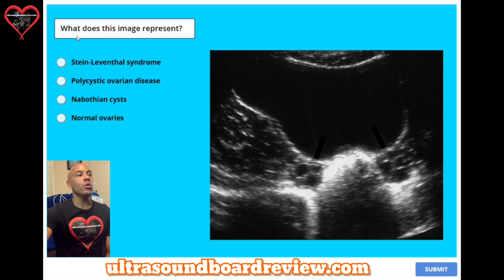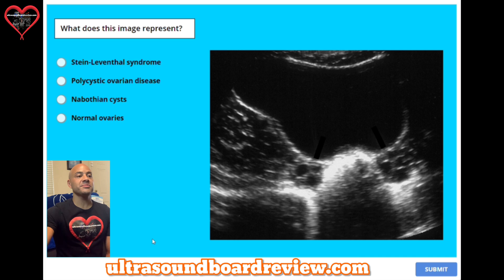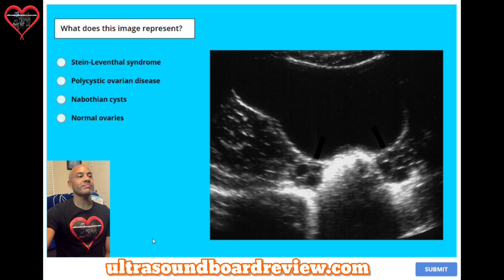Question 36. What does this image represent? A: Stein-Leventhal syndrome. B: polycystic ovarian disease. C: Nabothian cysts. Or D: normal ovaries? The answer is D: normal ovaries.